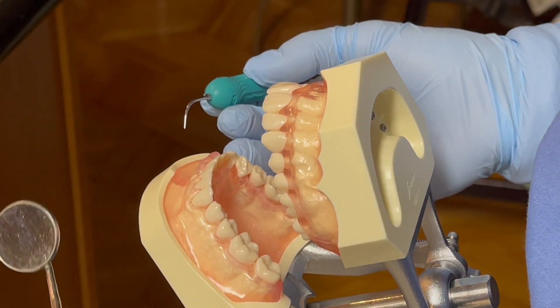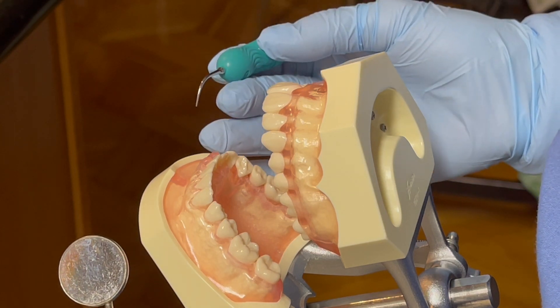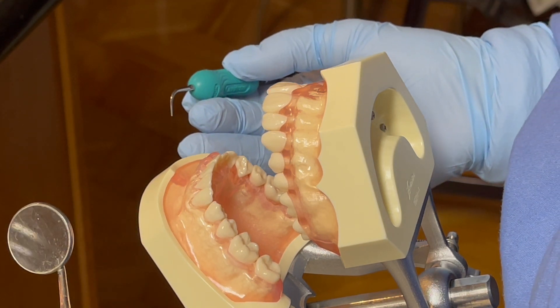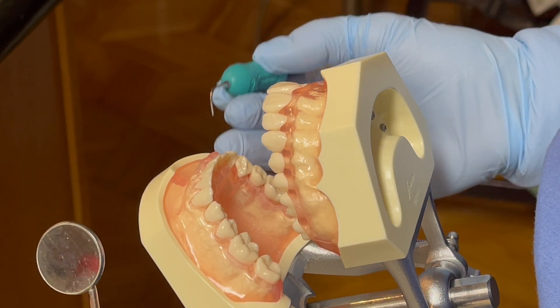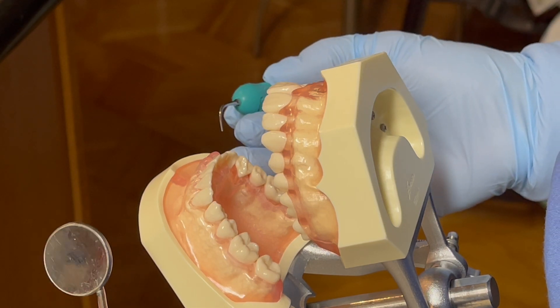For the 25-26 lingual aspects, I will be sitting at 12 o'clock with the patient in supine position. I will repeat the same procedure as the facial aspect for the lingual aspect of teeth 25 and 26.